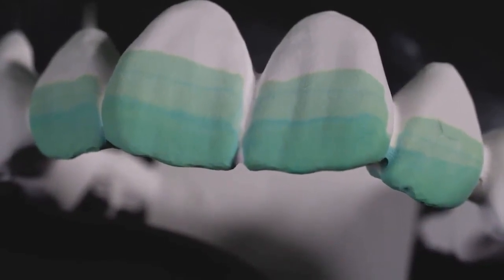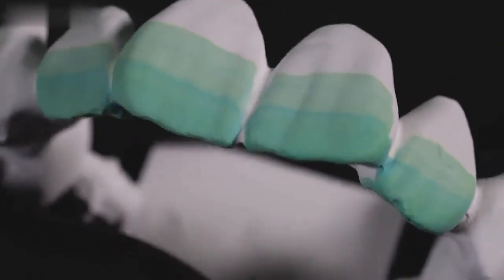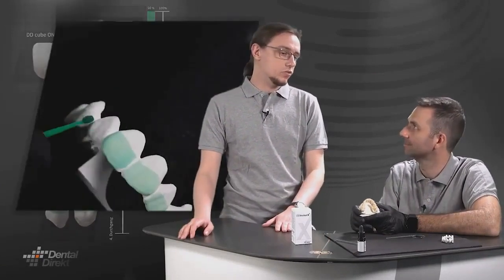And as always when working with liquid, don't forget to dry it. 10 to 30 minutes at 80 to 100 degrees in the convection oven are sufficient. Yes, Ballish, that was the application. It's that quick, that easy. Yes, it wasn't that fast, but I mean, we've also made it extra slow now so that you can really see how it works. Yes, in any case.